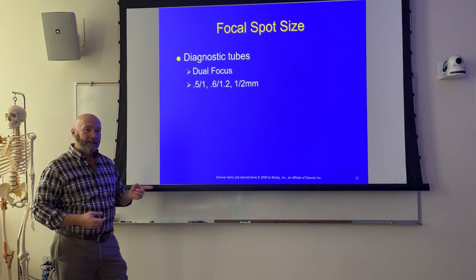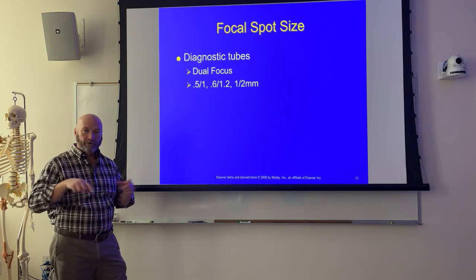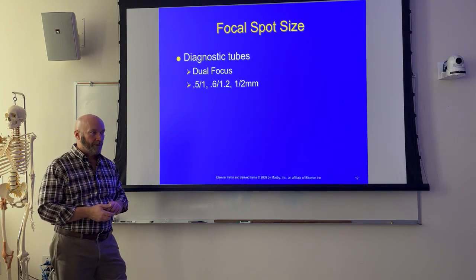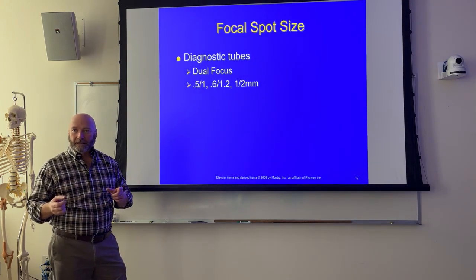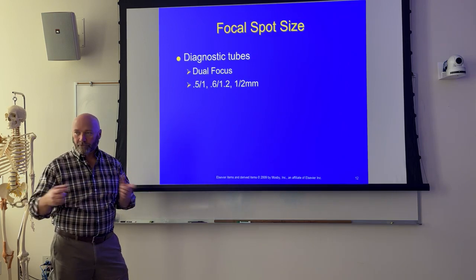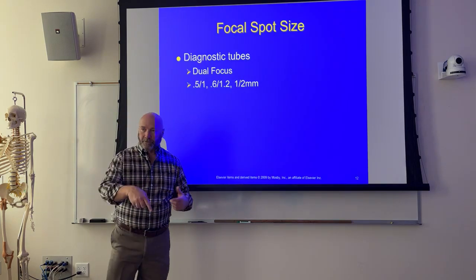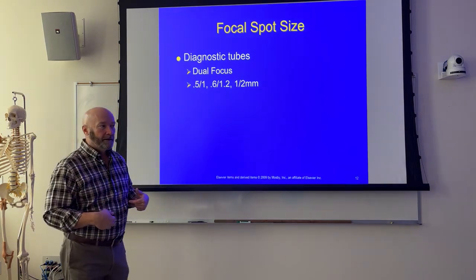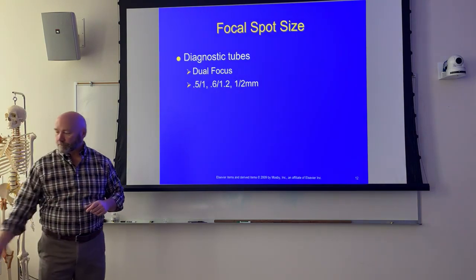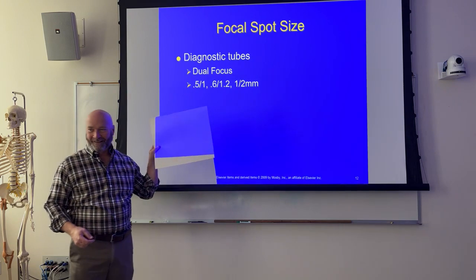So how you can tell that when you get into clinicals, just kind of go, shop around different anatomical parts on your control panel, and you can see what size filament it is giving you for each exam type. So you push the button for abdomen, and what it's going to give you is large focal spot. And how you identify the focal spot is, let's say, this is a button, all right?